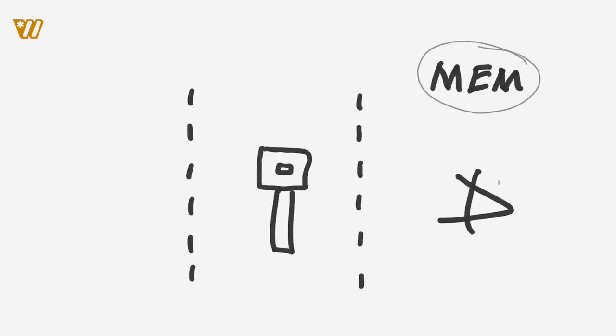So we've got our patient's eye here, right? And what we're going to do is they're going to be sitting there typically reading something on a card on our retinoscope, right? So we've got a card or we've got shapes that they're going to be reading depending on the age of the patient, right? And so there are 3 places that they can accommodate, right? They can either accommodate at our retinoscope, right? They can accommodate behind our retinoscope, right? Or they can accommodate in front of our retinoscope, right?